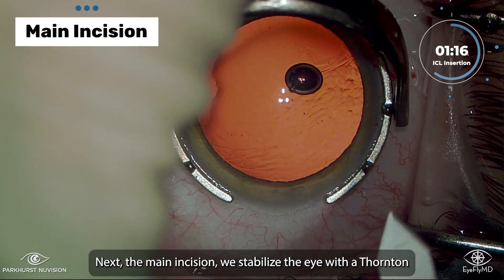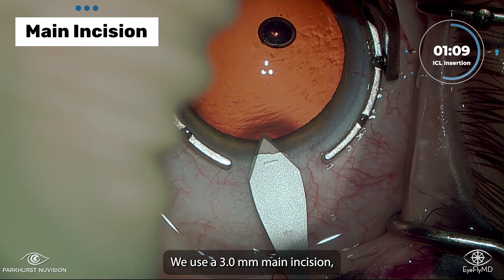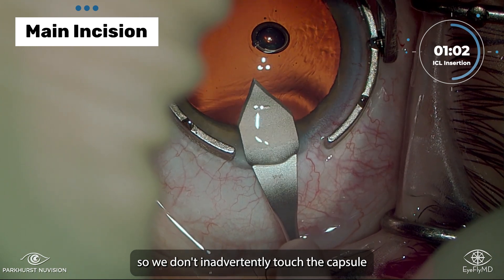Next, for the main incision, we stabilize the eye with a Thornton ring. It has to be at least 2.75mm — we use a 3mm main incision. Notice there's a slight upward angle, so we don't inadvertently touch the capsule.